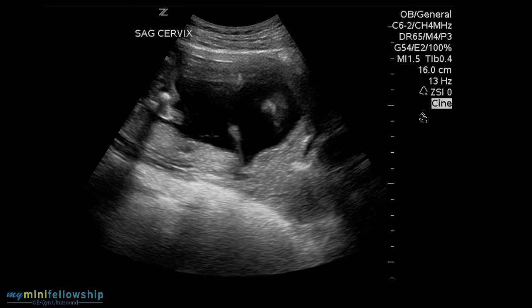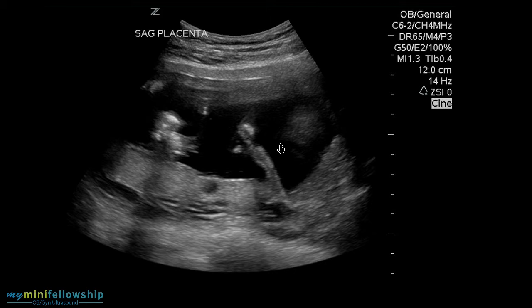which you would think, okay, well then that's definitely a circumvallate. But the problem is that these synechia are in one spot, and the placenta, as it grows, grows over a fairly substantial portion of the surface of the uterus, and it will bump into a synechia, and therefore it will appear to be at the edge of the placenta. So we can't use that as our sine qua non for deciding that this might be a circumvallate placenta.